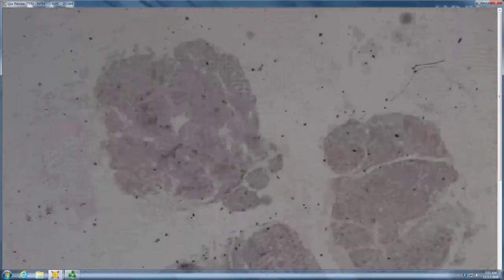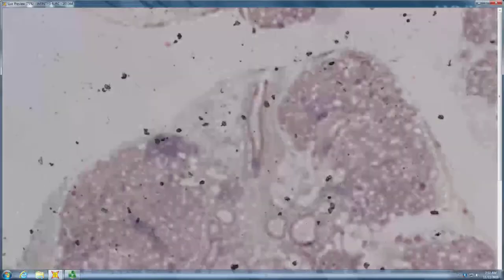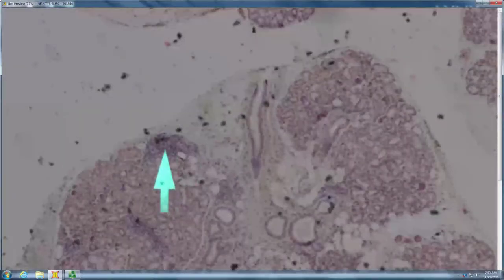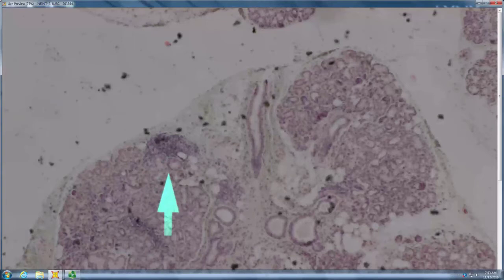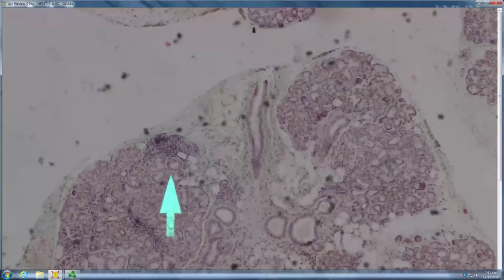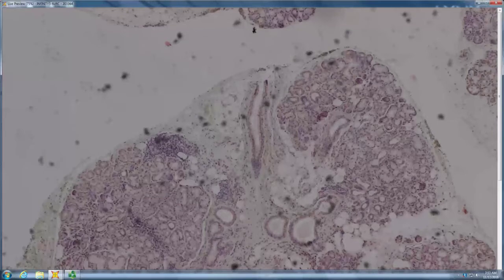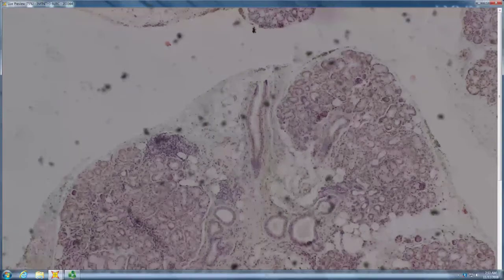Maybe like salivary gland. It's minor salivary gland. And is it happy or unhappy? Well, it looks like there's a little bit of inflammation. I think there might be lymphs. You have lymphs, and you have clusters of more than 50 lymphs, and you have multiple clusters of more than 50 lymphs, and you have lymphoepithelial islands. So this is probably Sjogren's. Oh, okay. Right. Yeah.